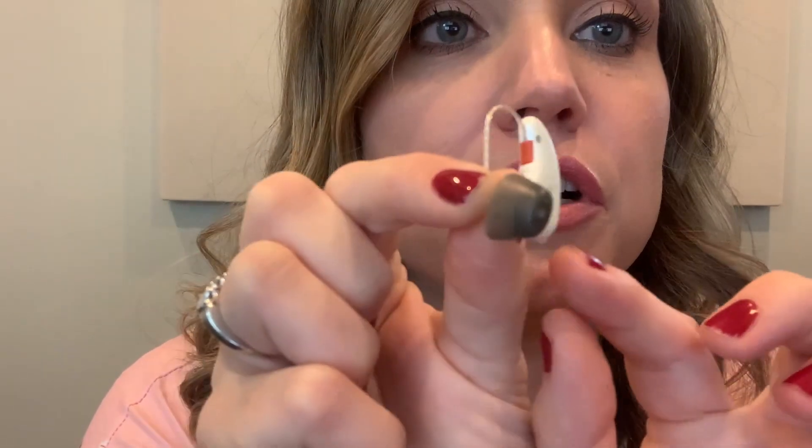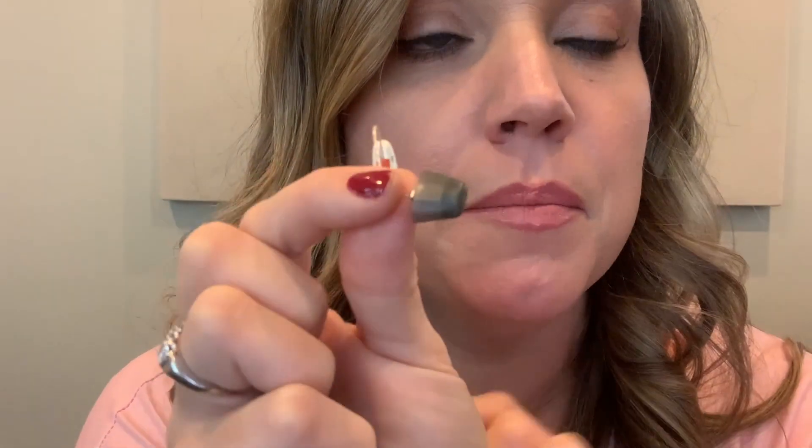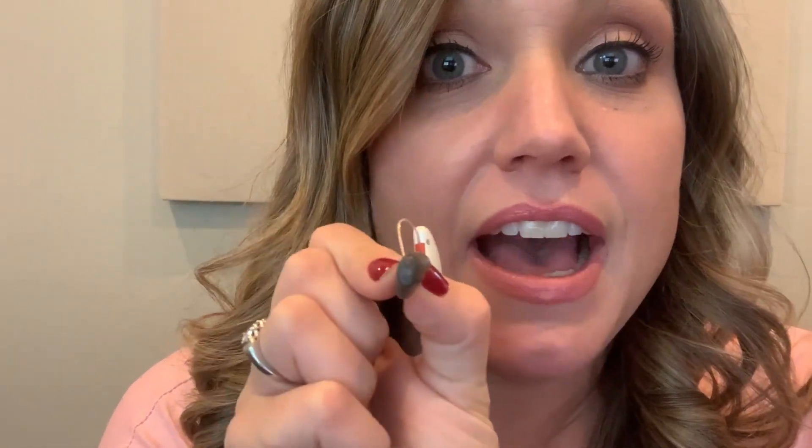Normally with other brands I wear a mold or an AP receiver. Signia has a 70 gain receiver and this click sleeve, and it is even more comfortable to me than the custom molds. My fit is occluded, so you have to get the right fit when you are occluded so that you don't get all the squealing and feedback when you have receivers this powerful. I started with a small click sleeve and I had some feedback and squealing, so I switched to a medium and that fixed it in a second. That was awesome.